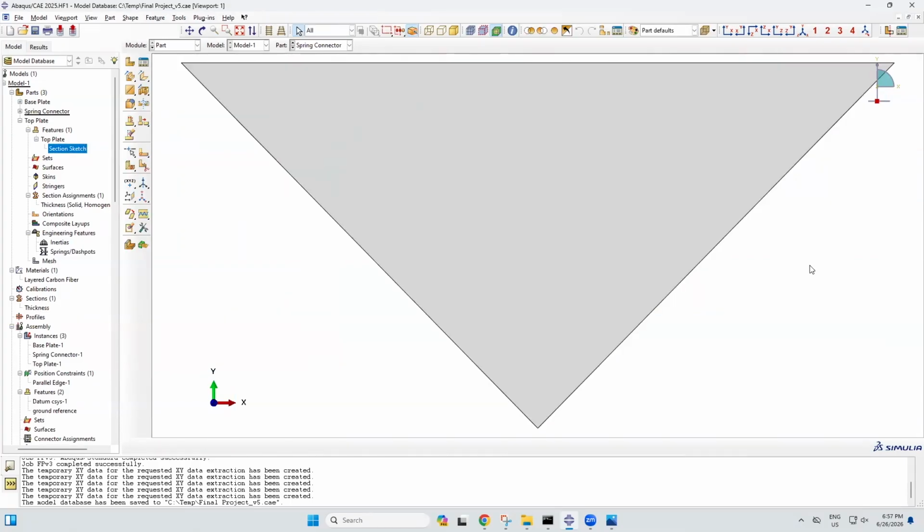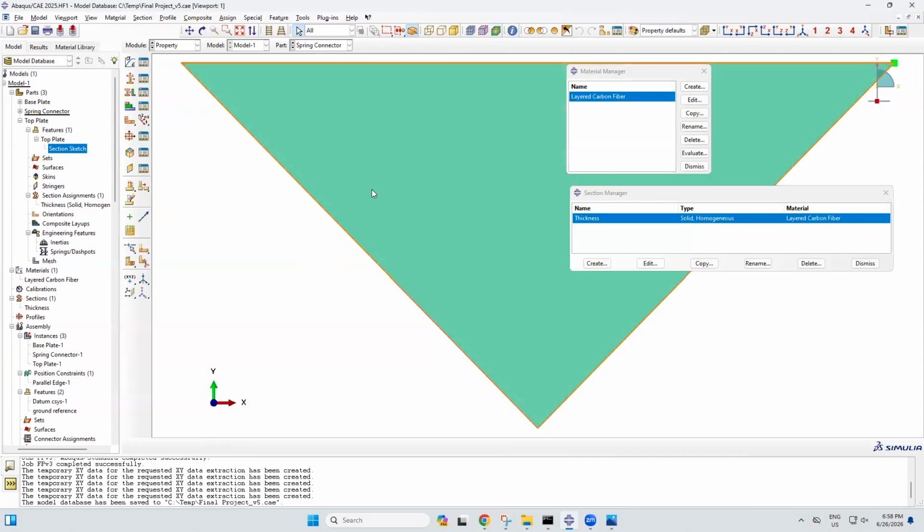The spring connector is to represent the connection between the foot prosthetic and the lower limb prosthetic. It also helps the spring be connected to the top plate as well. Up next is the properties.